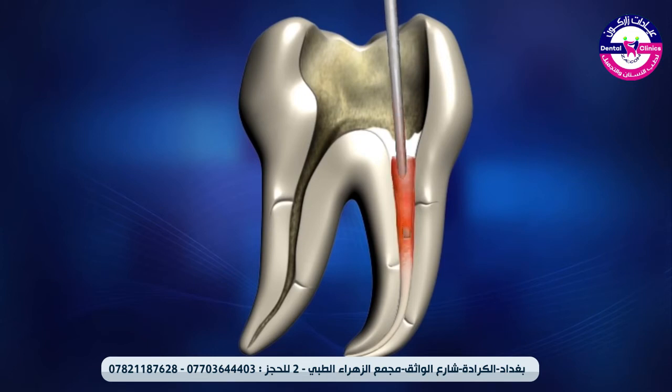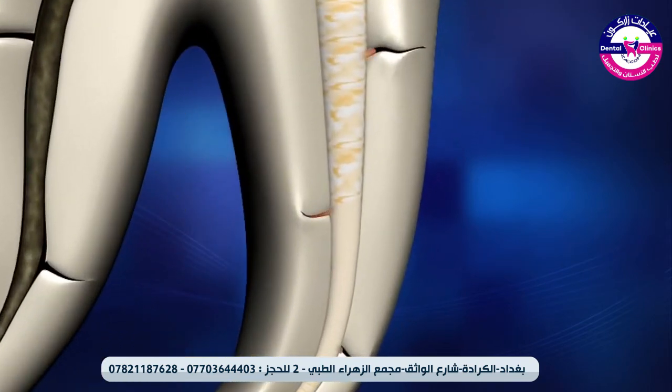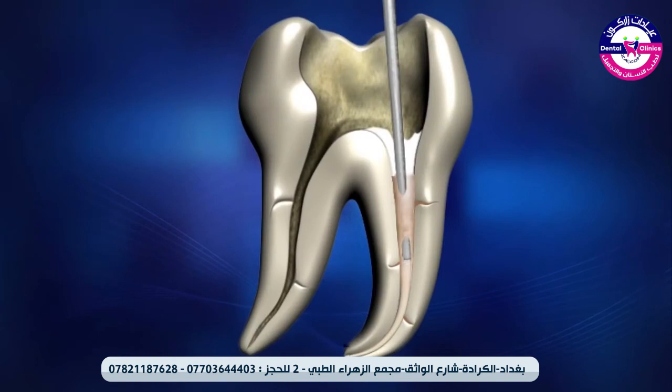Release the operation button. Push and hold the cooled pen tip. Packing down and applying pressure to the melted gutta percha ensures all the lateral and accessory canals are filled. Reheat the pen tip by pressing the operation button for half a second. Then, release the operation button to allow the pen tip to begin cooling, while at the same time, wiggle the unit and remove the tip quickly from the canal.